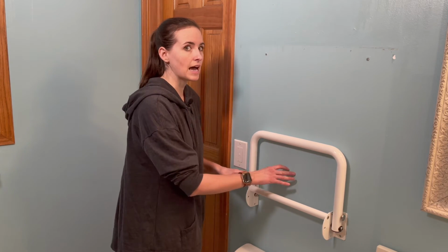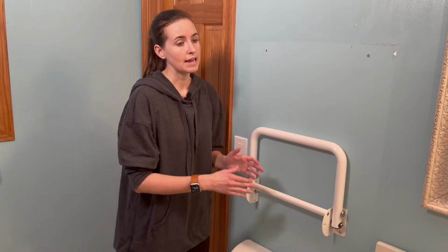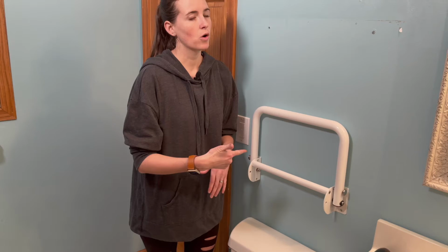Now, the traditional fold-down grab bar that many have seen probably is the kind that folds down next to the toilet, reaches out long, and provides you a side stabilizer when you're getting up and down from a toilet that doesn't have a wall available. This is a little different in that it folds down towards the toilet, and it can be behind the toilet or in front of the toilet. It has a lot of purposes, but I want to go over it from here because I absolutely love this design for some very specific problems.